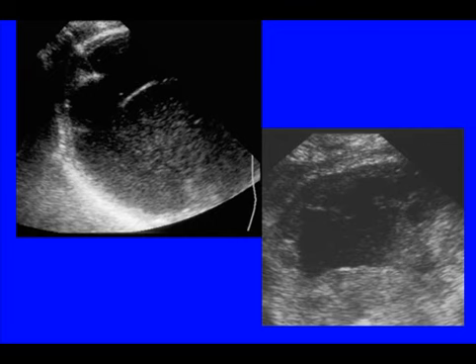And here's a case. A patient presented with a large complex mass, and we drained it using transvaginal guided aspiration. As you can see here on the right, we didn't drain it completely, and usually you don't, but enough that you can start treating the patient with antibiotics.